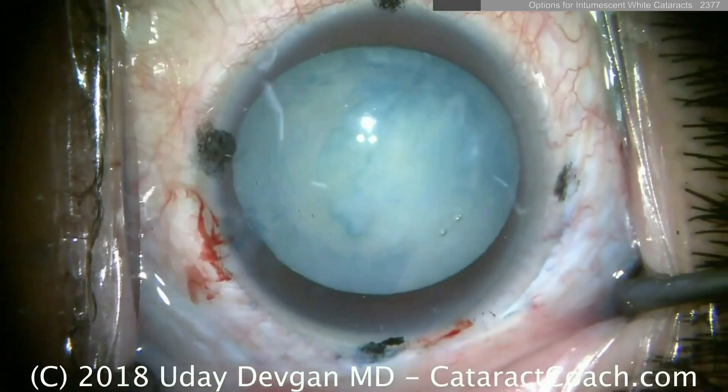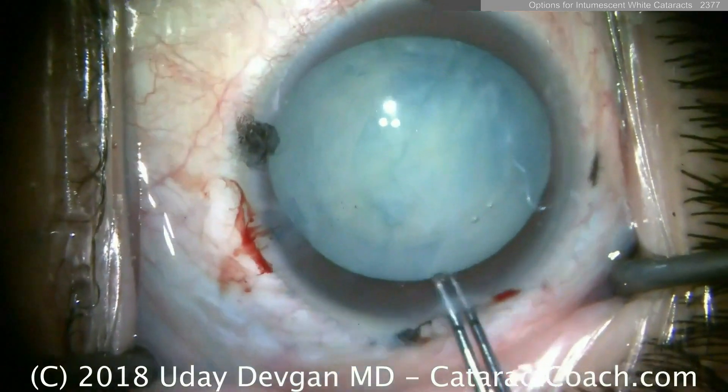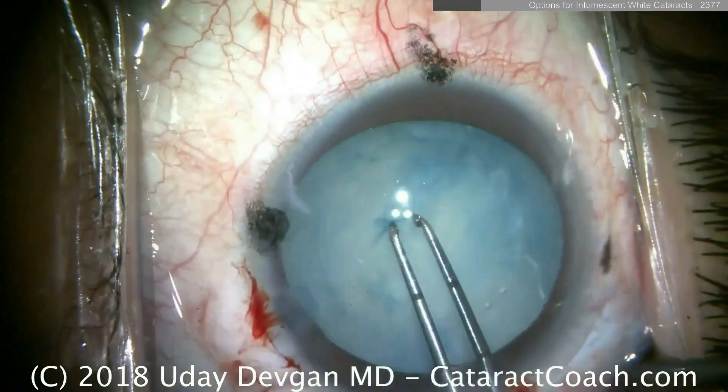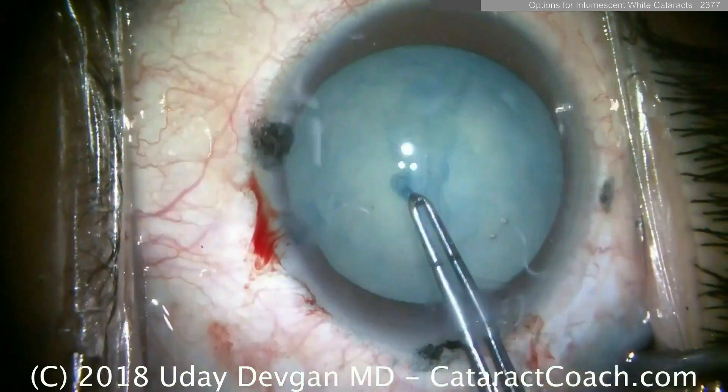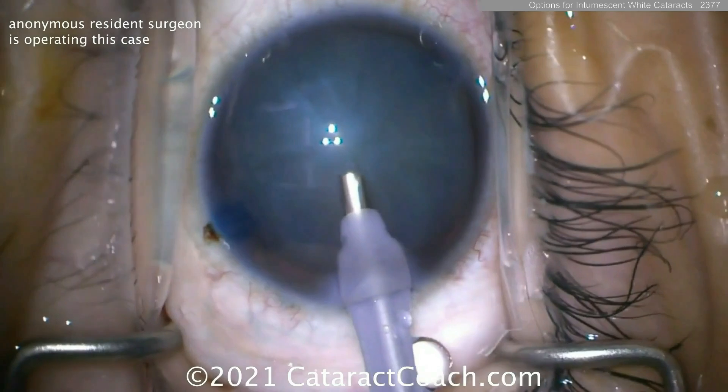As the laser starts to puncture the lens capsule, liquefied lens material leaks out. So going inside, you can see there's still a couple of attachments — there and there — and now you can complete the case.